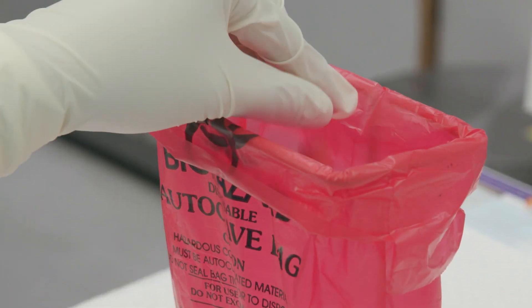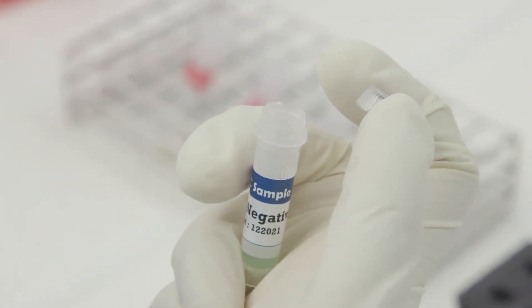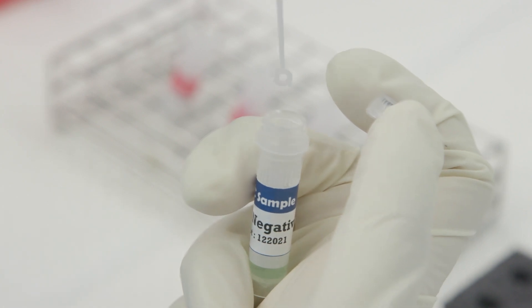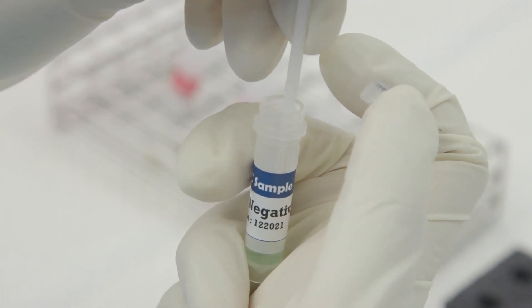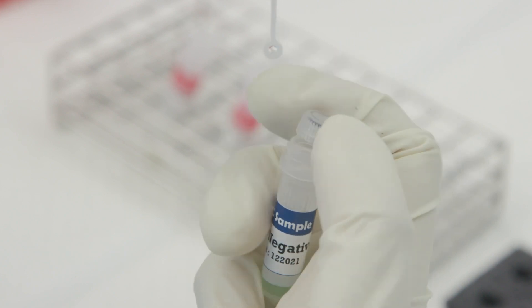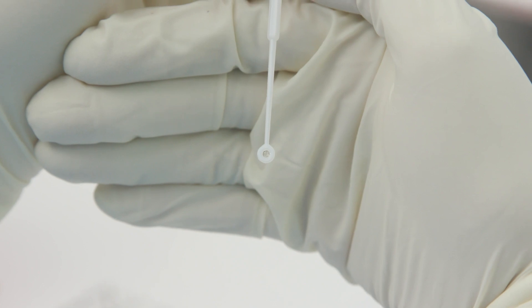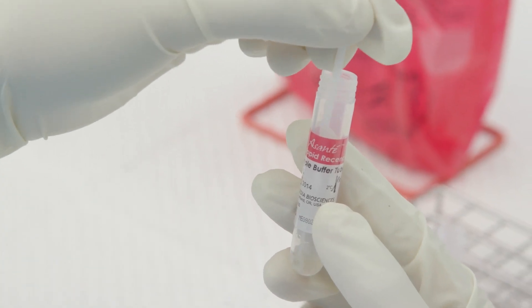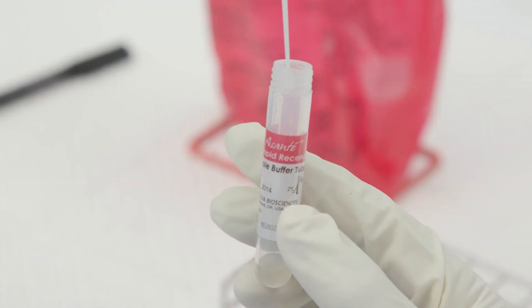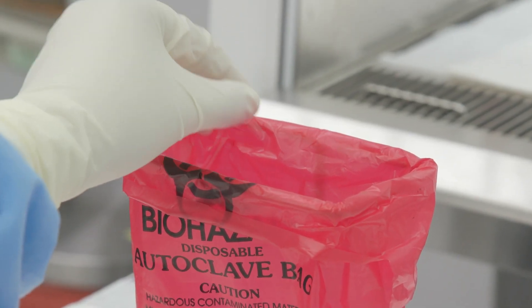Step 3: Remove a specimen collection loop from the vial of loops in the kit. Step 4: Dip the round end of the loop into the quality control sample. Step 5: Transfer the loop full of sample directly into the open sample buffer tube and spin the loop in the tube to thoroughly mix the sample with the sample buffer. Step 6: Discard the specimen collection loop into a biohazard bag.